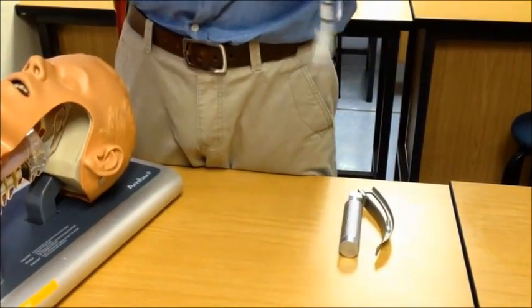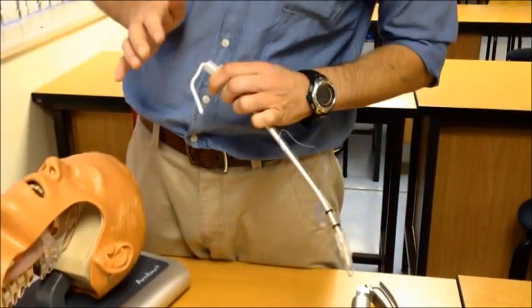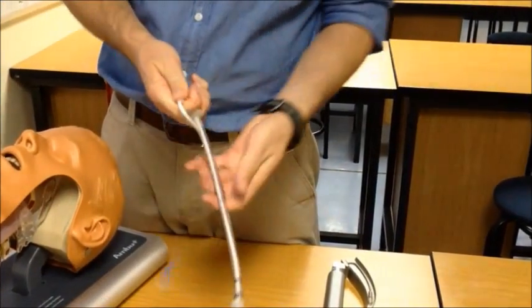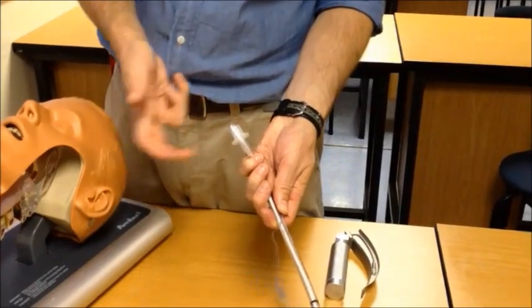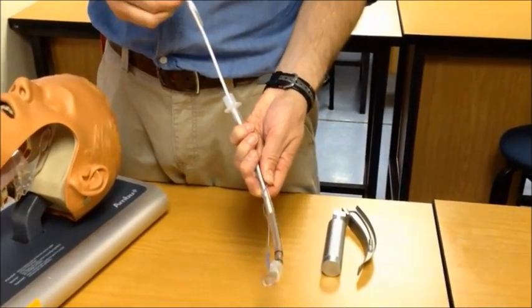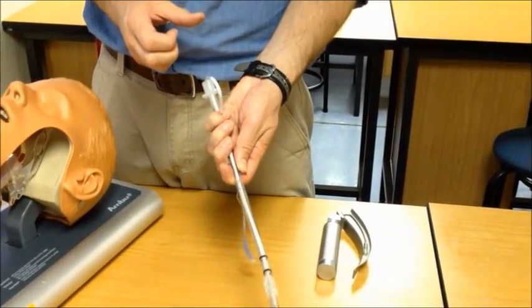Now bend the stylet over at the edge to prevent it from migrating deep in and then bend another little loop, making a secure hold for you to pull this out. In this way you can easily grasp and remove the intubating stylet and at the same time it will not pass beyond the edge of the tube.